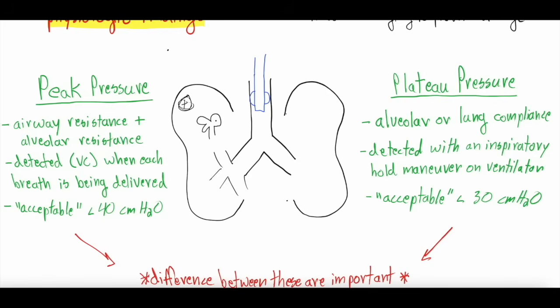And these are kind of balloon-shaped alveoli. That's a really terrible drawing. Let's try it again. Terminal alveoli, and these are the little balloons that actually inflate and deflate for gas exchange. This blue thing here is an endotracheal tube, right? There's a plastic tube that goes into the trachea. You blow up a balloon here so it forms a seal, right?